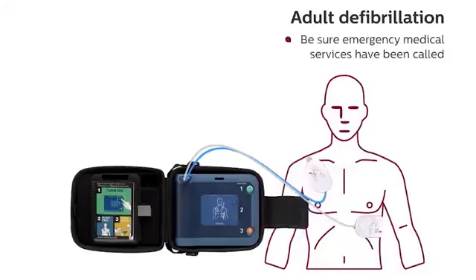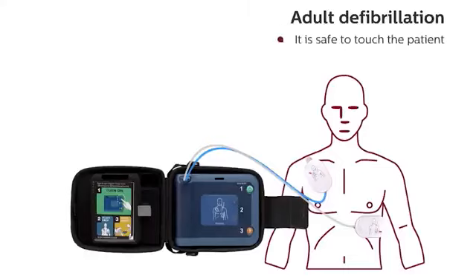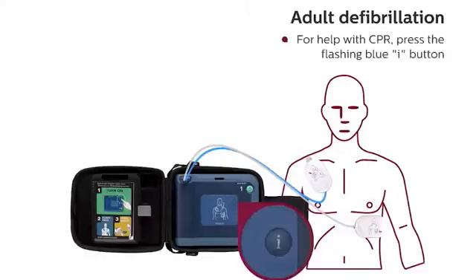Shock delivered. Be sure emergency medical services have been called. It is safe to touch the patient. Begin CPR.